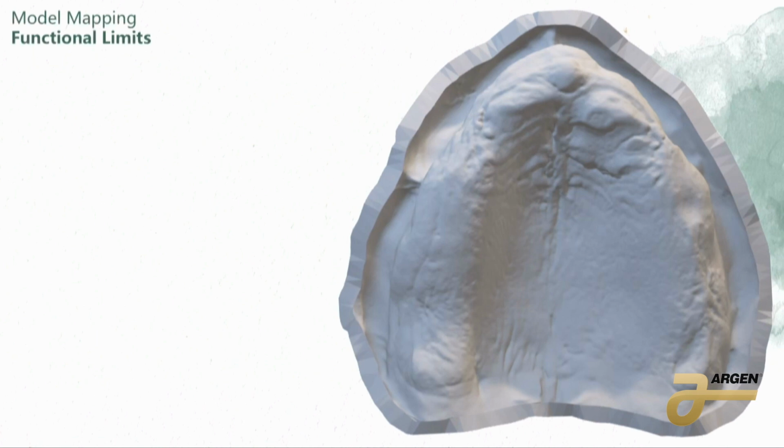We don't know how far forward. We don't know where the canines might be. Sometimes we don't even know where the midline is. It's just a bite, and that's it. So we need to understand how to read our models to get as close as we possibly can without this information, right? So how far anteriorly are we able to set those teeth before they're out of function? If they get out of function, that means they're not able to chew, speak, eat, all those things, right?